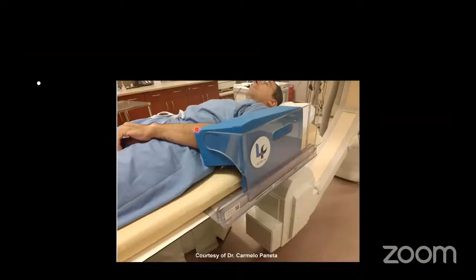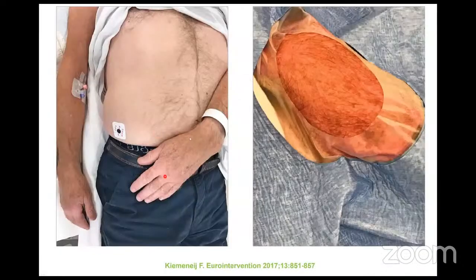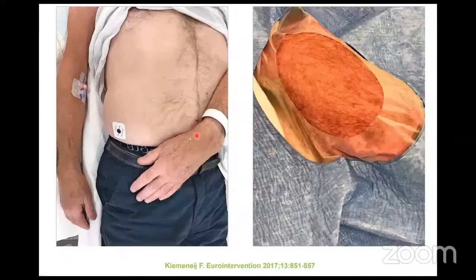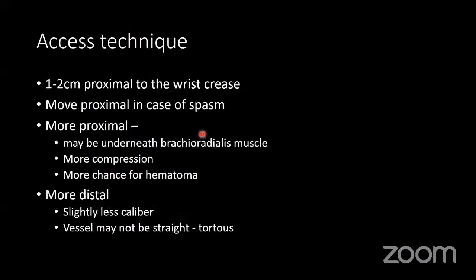This is almost the position I have mentioned right now. So the upper limb will be in the midline, and for the left side it is better to get an anatomical snuffbox approach, because it is difficult to make this hand supine, so that the tension in the limb will be less if we approach through a distal radial access.